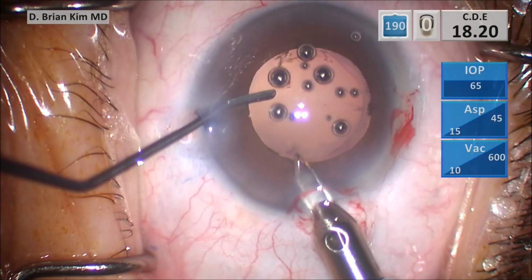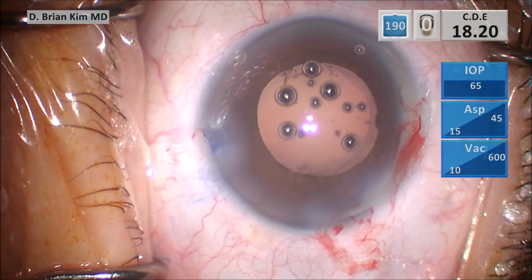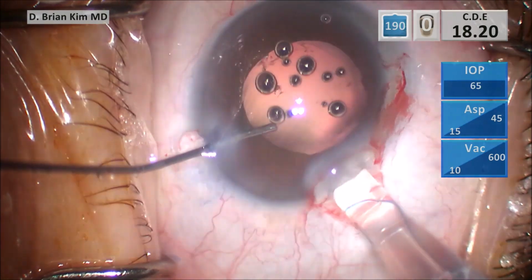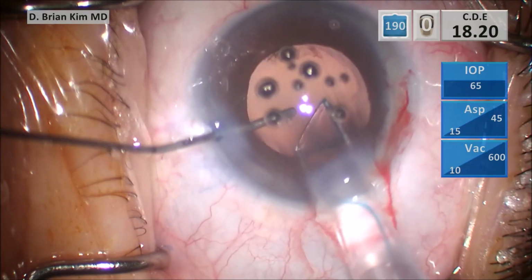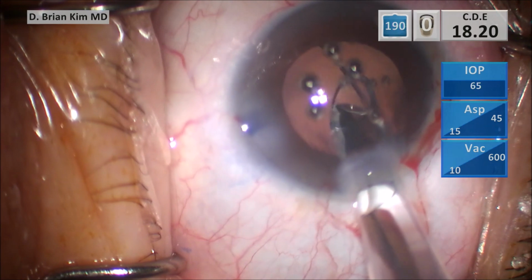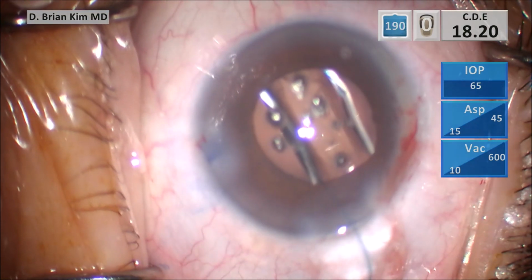I widen the incision with my blade because this is a 3-piece lens. And when I put in the 3-piece lens, I do have to wiggle it a little bit. And as I wiggle it, OVD will come out from the incision, which will cause the bag to collapse. So I like to use the cohesive viscoelastic cannula to hold the eye. And then I just push cohesive viscoelastic into the bag. The leading haptic goes into the bag, the optic going in as well, and then I use a Maltzman to dial the trailing haptic into the bag.